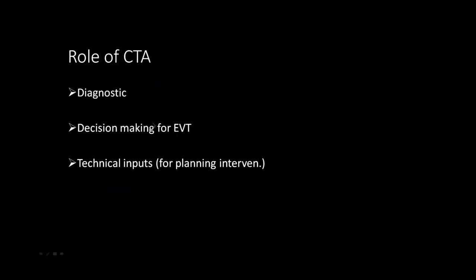In our institution, the CT is the main workhorse, mainstay of this stroke diagnostic workup because more than anything, we need to mute some of the, I think. Yeah, thank you. I was telling that in our institution, CT forms the mainstay of the stroke workup.